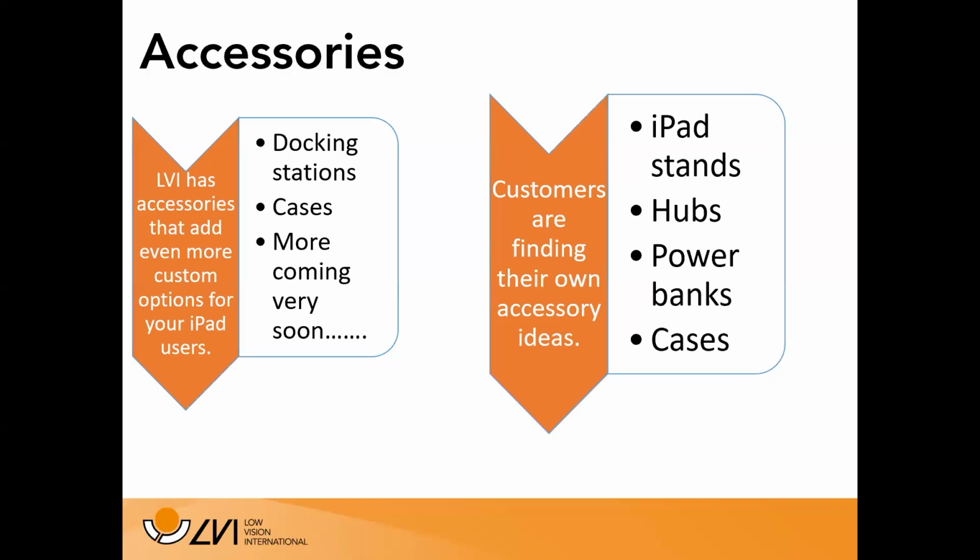Another accessory that LVI has: we have excellent cases for all of these cameras. They have a high contrast orange interior. They have sturdy reinforced corners, and they are lightweight and do a great job of containing our products and protecting them. And as I mentioned earlier, we are really attuned to our customer base and listening to feedback. Some feedback that we've received recently, and I've taken to the leadership in Sweden, is what about some accessories for that Magnilink Mini?